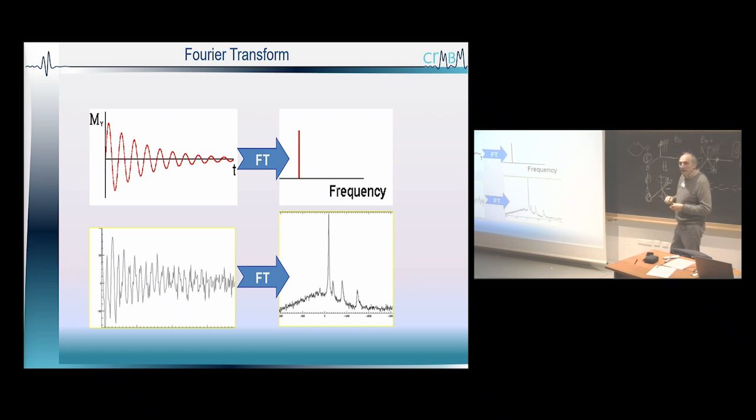And it won't be the same position, it won't be the same identity in the spectrum in here. It will be the same if you do proton spectroscopy. You've got water, which is more or less always water, but for fat, you've got different types of fat molecules. You can have one like this, or you can have one with a double bond in here, and so the proton in here will have a different electronic environment. So you will have not only one frequency of fat on the spectrum, but more than one. You will have multiple fat peaks in the spectrum in here.